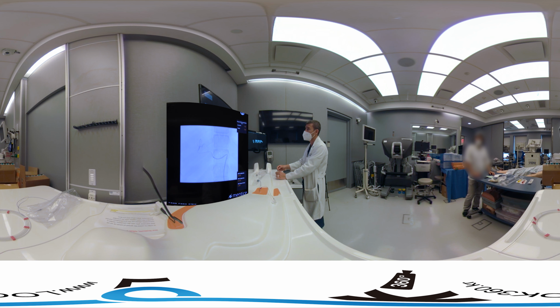So you can see here I'm pulsing in, it's starting to collect within the tumor. You can start to see the tumor kind of filling with contrast and the embolic material. Alright, we're going to continue to give, and now you can see that we've gotten close to stasis. You know, we're risking a little bit of non-target embolization, so we kind of want to end at this point where it's static in the vessel. So it's a good endpoint for us, and that's a good portion of embolization that we did there.